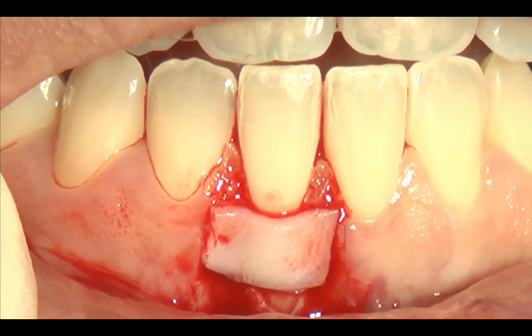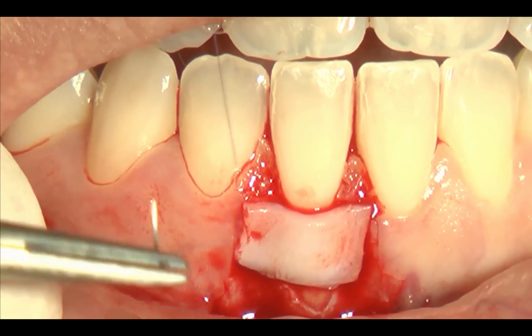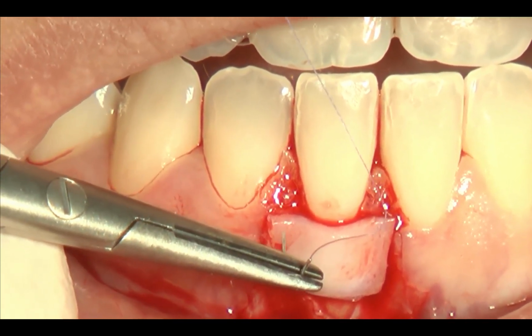Now we take the short needle, and it's very important to get inside.